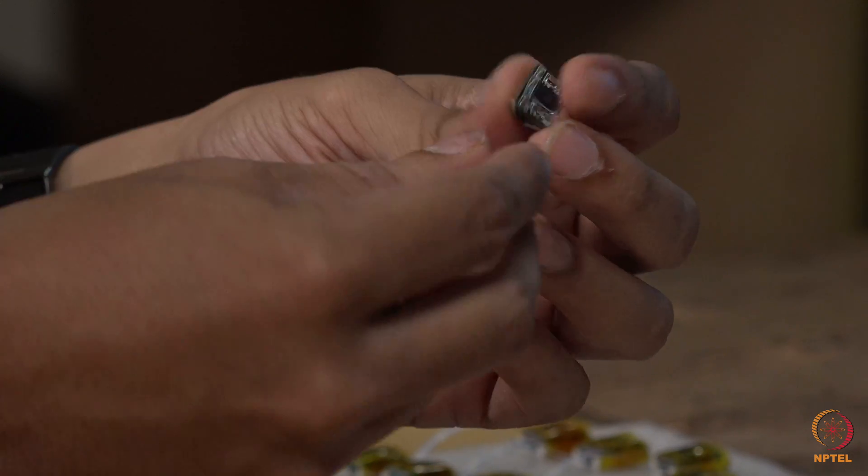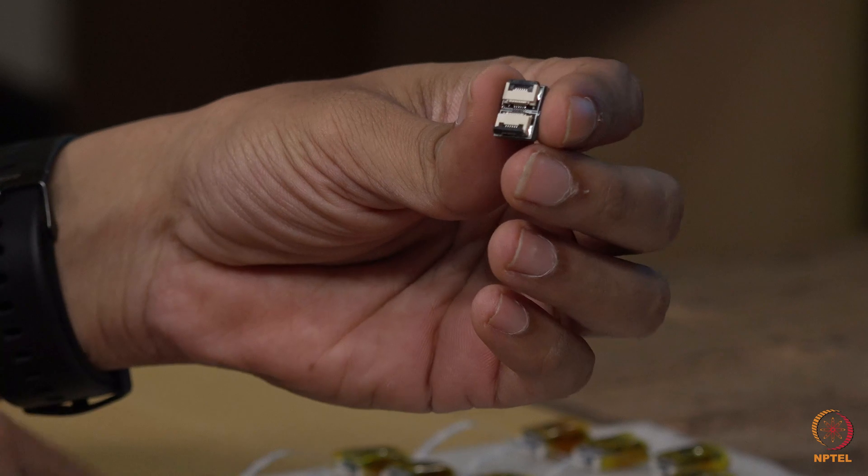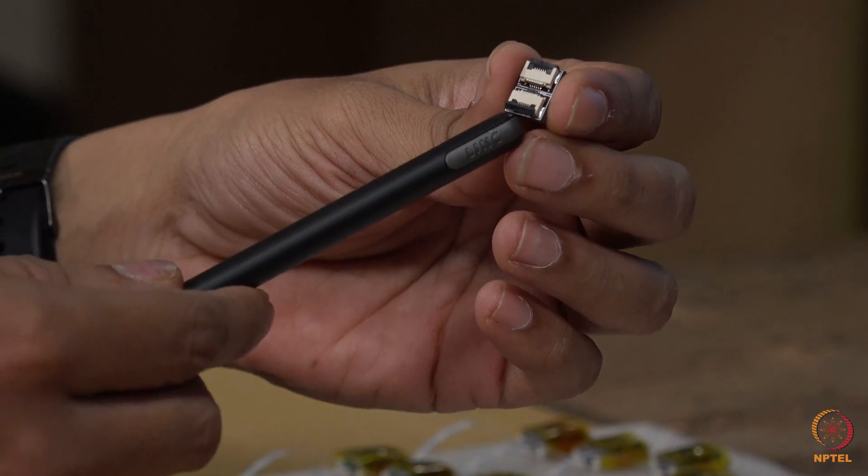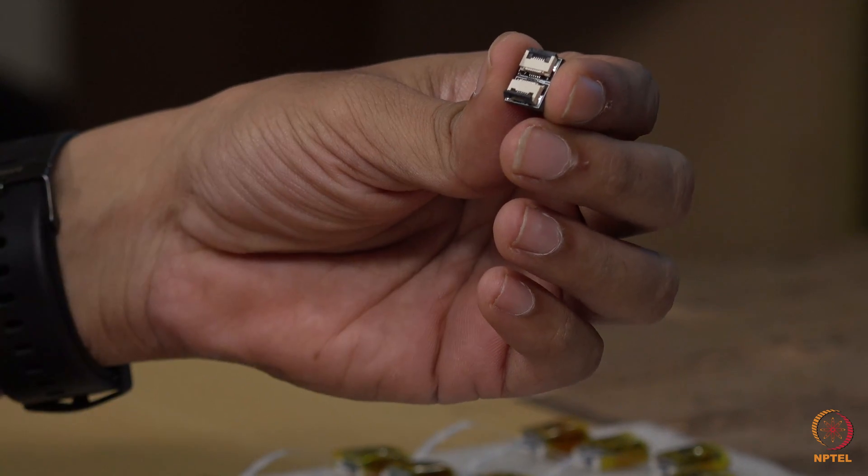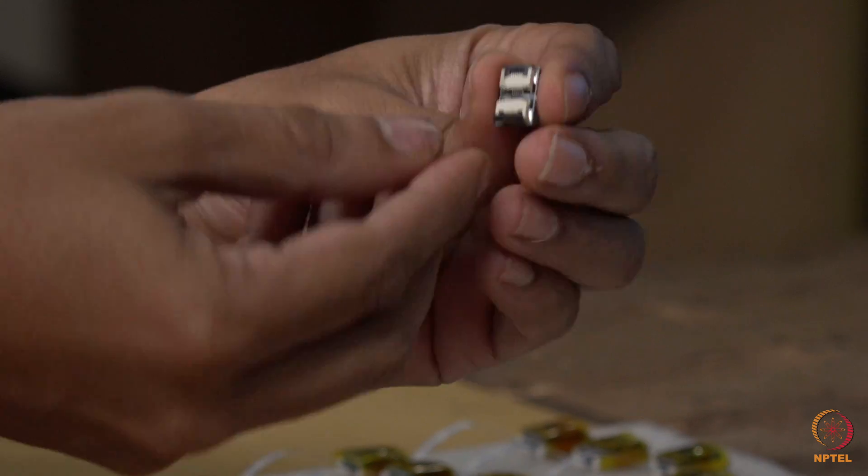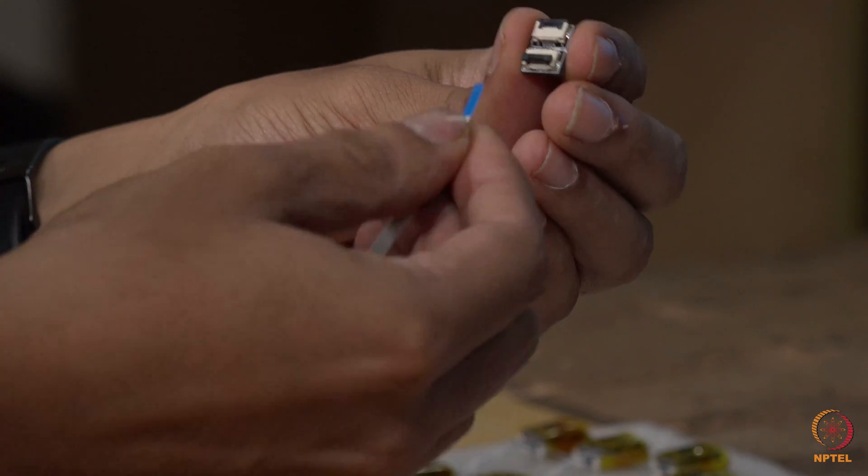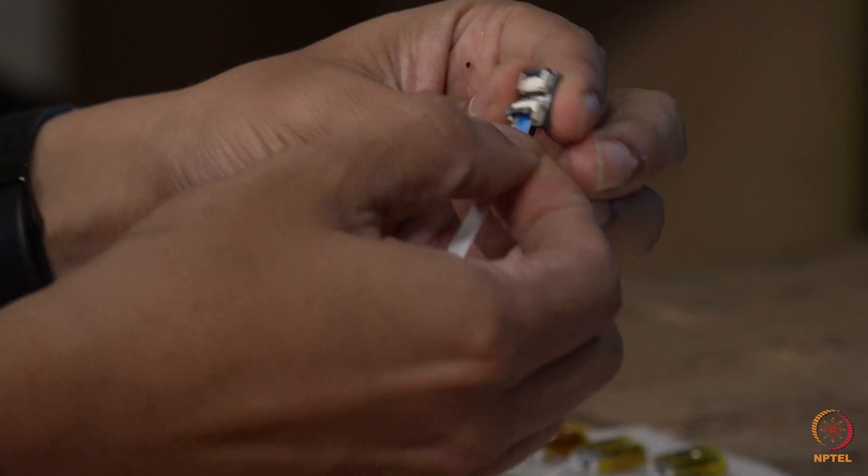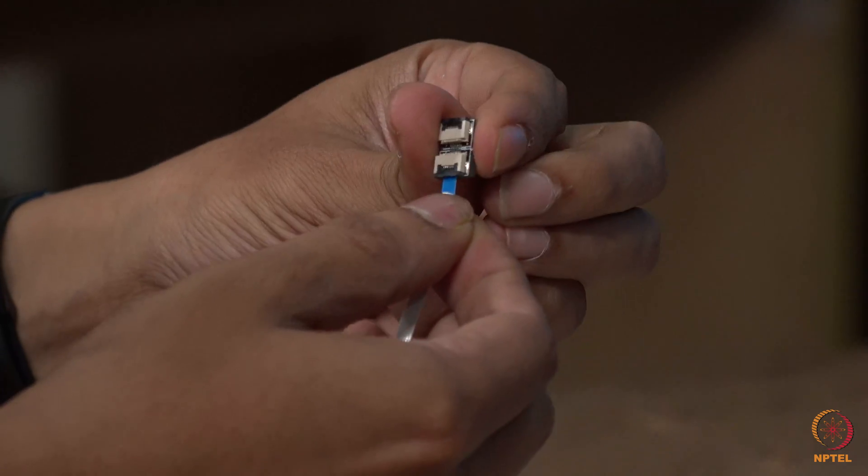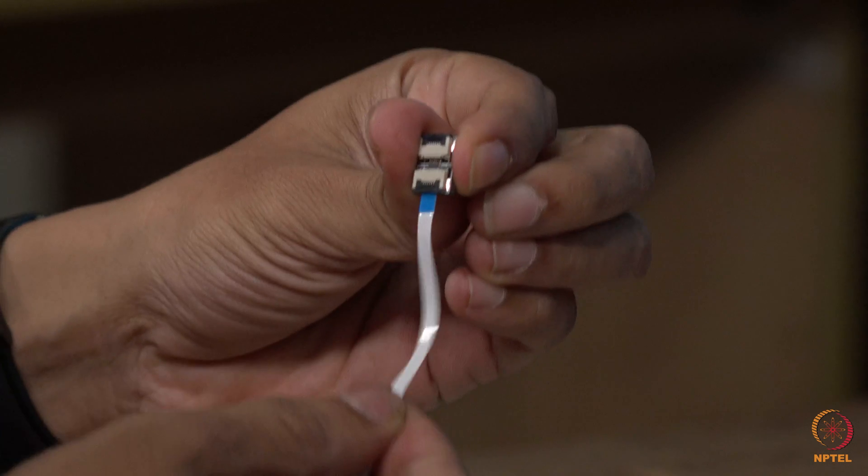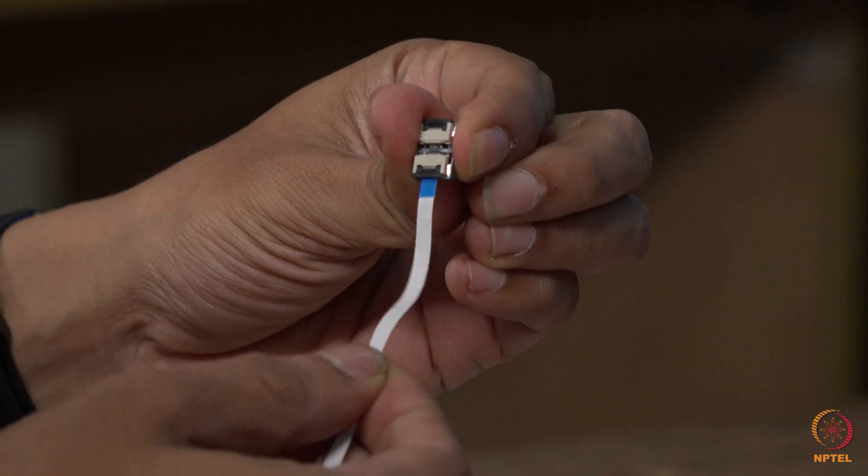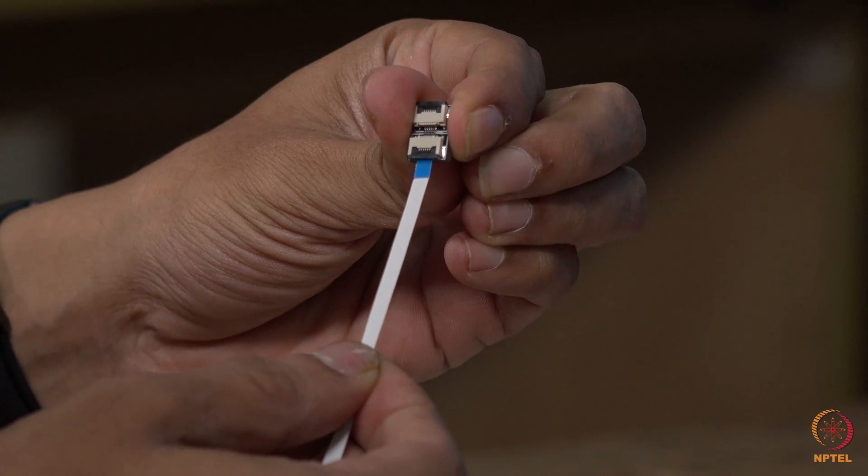On the back, there is an option to attach the FFC cable with the help of an FFC connector. This can be connected to the FFC cable and snap fit the cable in place. This forms a very rugged contact and will not snap out during the operation.